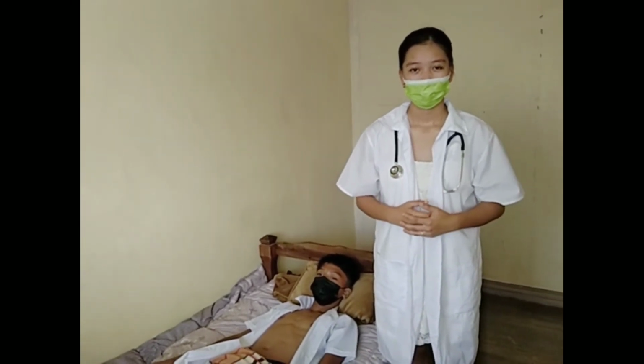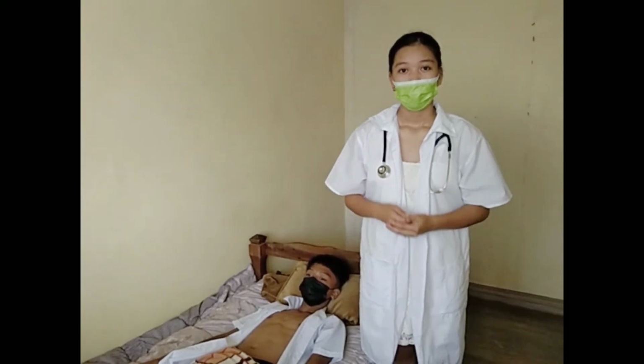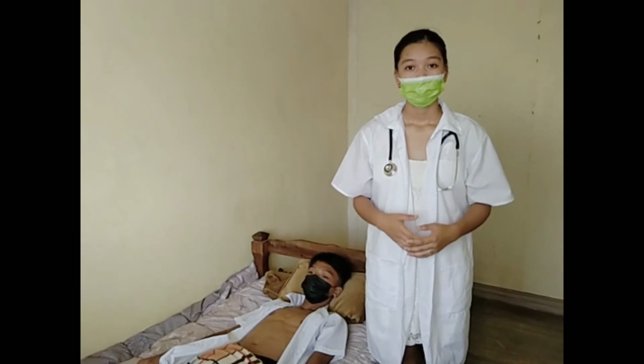So now, let's proceed to the auscultation. Assess for heart rate and rhythm by placing the stethoscope at the apex and listening closely to the rate and rhythm of the apical impulse. Count the heartbeat for a full minute. If irregular rhythm is detected, assess for the pulse rate.